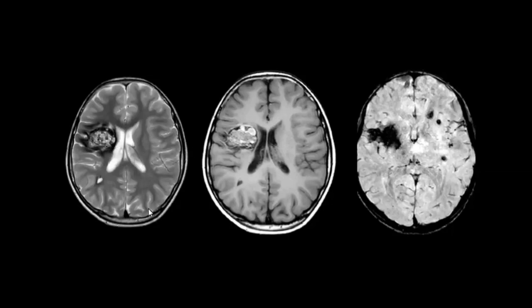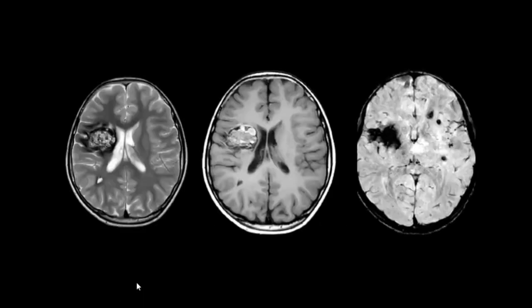So in the context of the previous case, I said that we have to search for more. So this is a familial cavernoma syndrome. It has similar signal intensity, similar blooming, similar T2 hemosiderin, but there are more than one in this case. So it is in a small young boy. It is a familial condition, and it is called familial cavernoma syndrome.